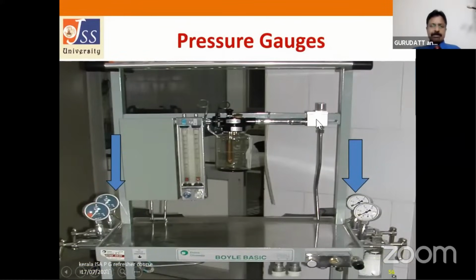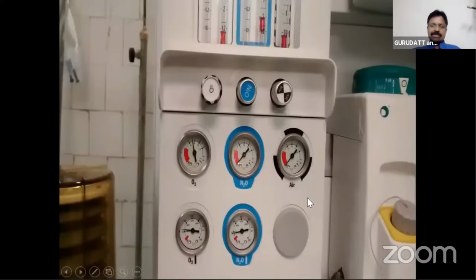Now coming to the pressure gauges. These pressure gauges were just above the yoke assembly in the older machines, but in the newer workstations, these pressure gauges have been shifted to the front because the yoke assemblies have been shifted to the back. So the pressure gauges have been shifted to the front.